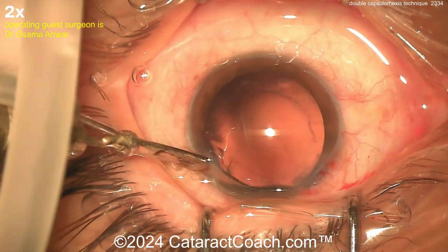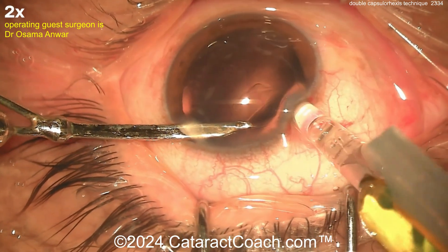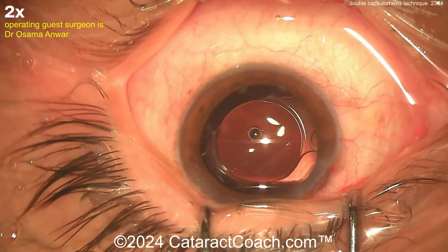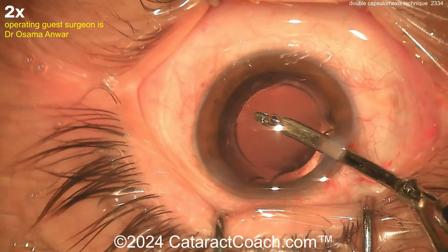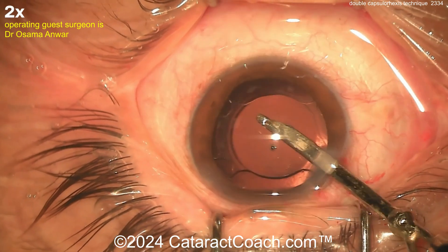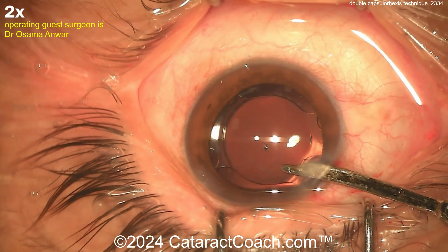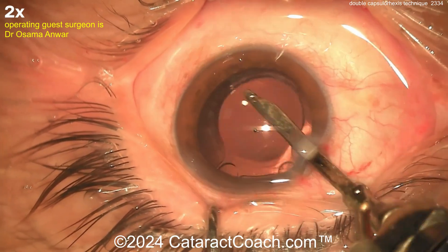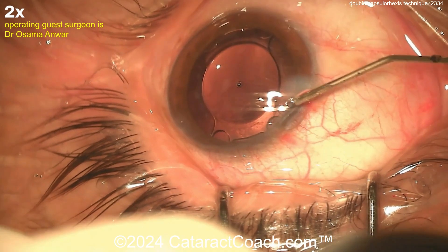In these eyes, your lens calculation is going to be a little more challenging, because you don't have an optical way of measuring the axial length. What I do is use an ultrasound A-scan, and I'll A-scan both eyes. If the patient has a less severe cataract in the other eye and you can get optical biometry of the second eye, then do an A-scan of both eyes — including the eye you already have an optical axial length for — just to see if your technique or calibration is consistent that day. If the A-scan reading on the good eye matches the optical biometry axial length pretty closely, then you can be confident the measurement for the white cataract eye is accurate too. When in doubt, for most cases a little myopia is not a bad thing: if your lens power is in the 20 range, it's okay to add a little extra and let the patient end up slightly myopic. If the eye power is on the higher end, aim closer to plano since the patient is used to being hyperopic.